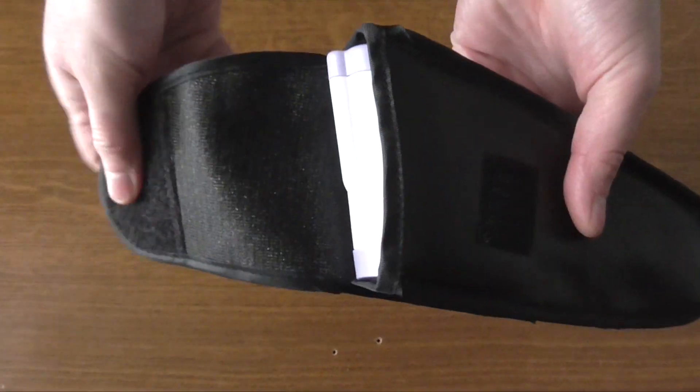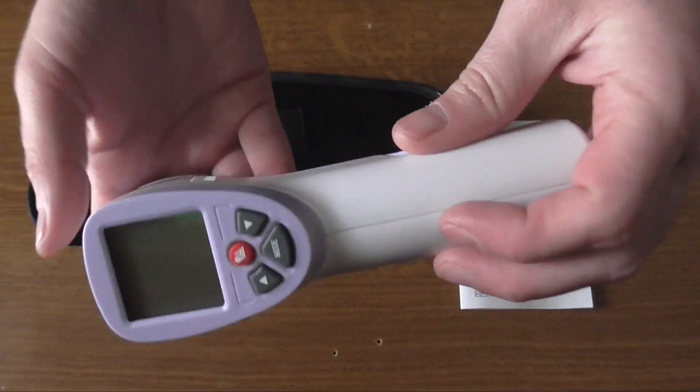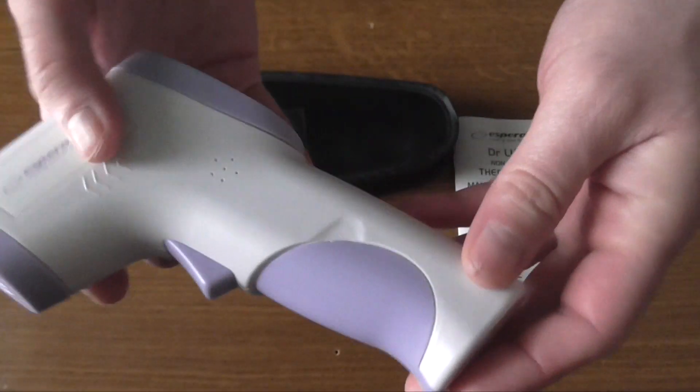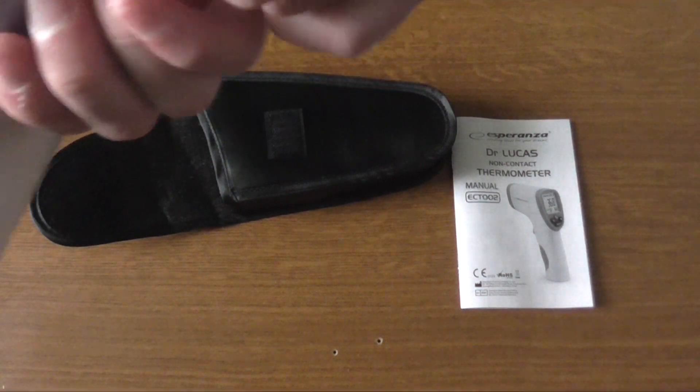Getting out of the case, the thermometer itself — as you can see, this is a pistol-like thermometer that has an LCD and some function keys. This is the infrared sensor in front, and there's a trigger that is used for measuring the temperature.